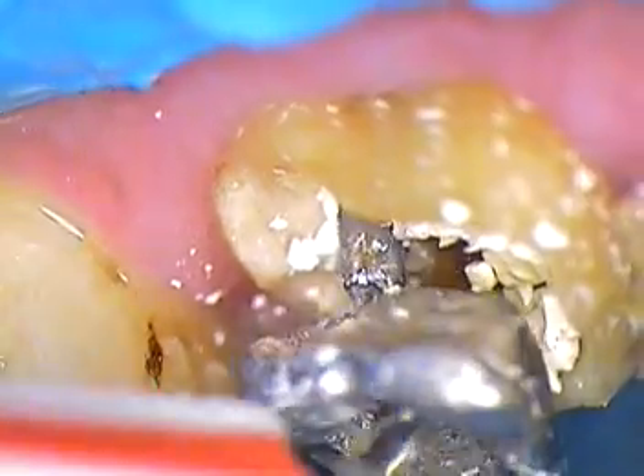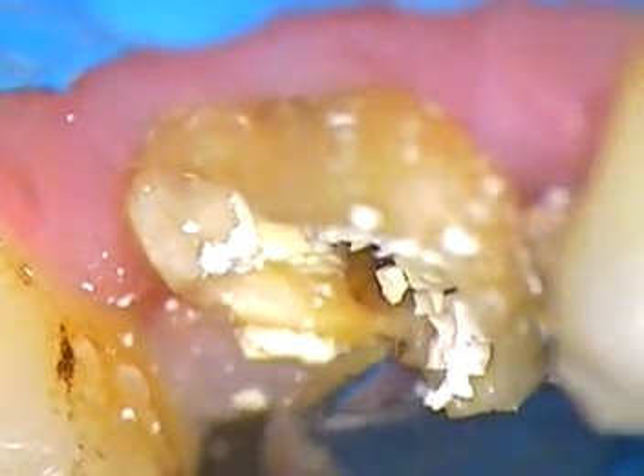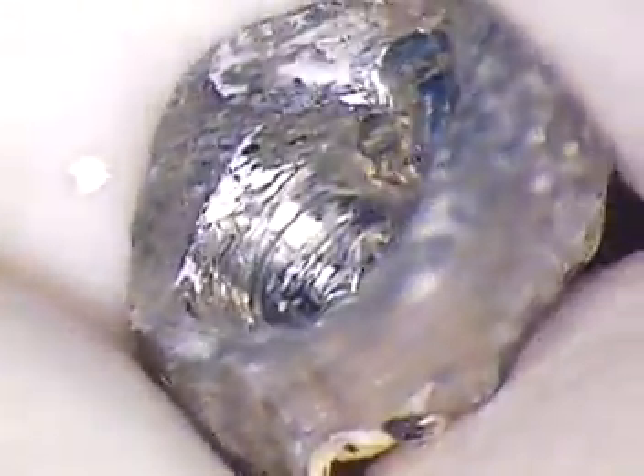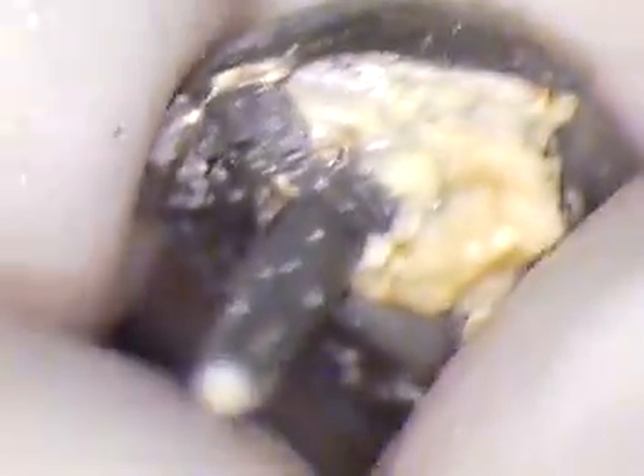There it is — it's loose. We got it. Here it comes. All right, how about that? That was pretty exciting, Pierre. We got it. And we'll take a look at that right now. Now as we were looking at this — I don't have an x-ray but there's the casting. Our biggest fear was that I was barreling in and going to decapitate this, but evidently didn't need to go any further. The vibration simply got it out. So there's your post, nice and smooth — it must have been a tapered type of post. Here's the attempt where the endodontist tried to go in and just felt it was unbearable. You can imagine he would have had to go all the way past the thickness of this core just to get to the post and make access. There's the old cement underneath — that looks like a zinc phosphate cement. So the gods were with us here.